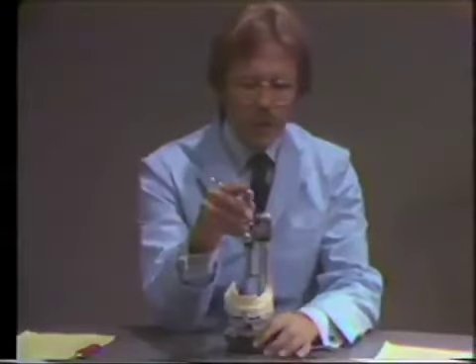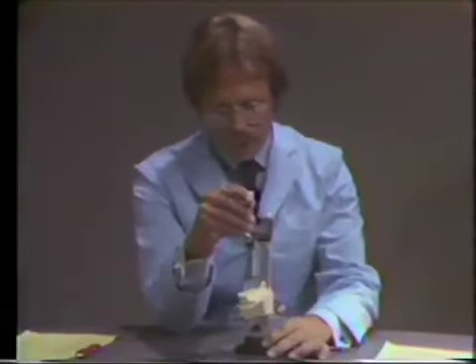Now you can see that 20 thousandths undercut is not that much, and I have it very easily on this tooth. We see this little triangle here, ensuring that at that point, if I brought my clasp at that point with a finished partial denture, I would have engaged 20 thousandths of an inch undercut. Now that's for the bicuspid tooth. Now we know that we will have control of the opposite side, our other potential retentive area, our other potential primary abutment being the molar.